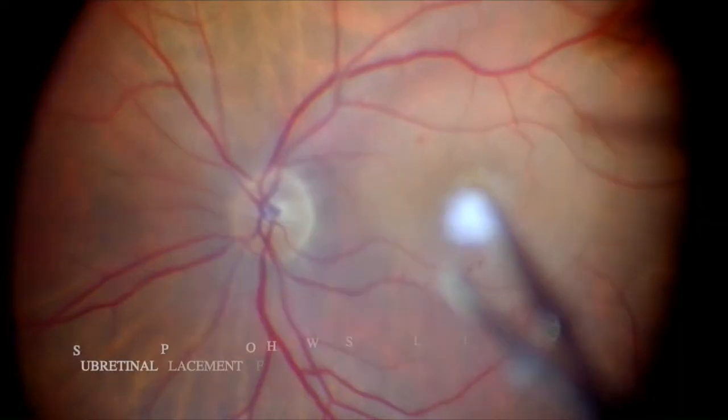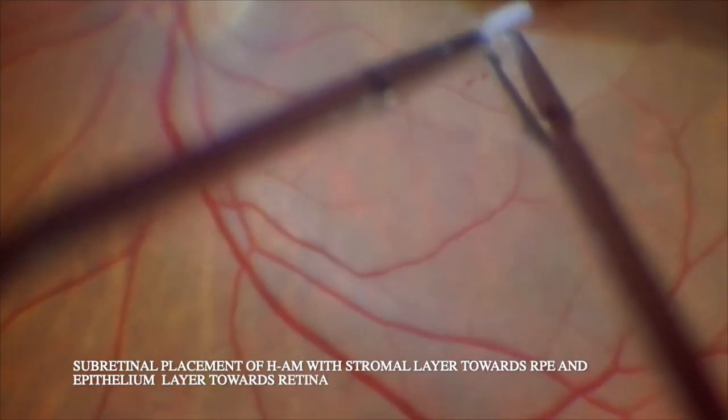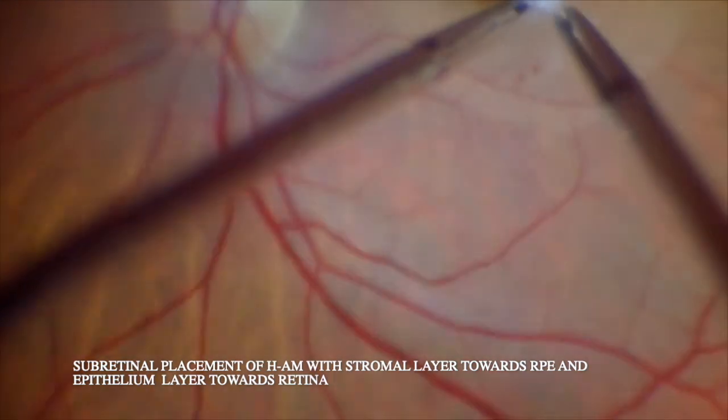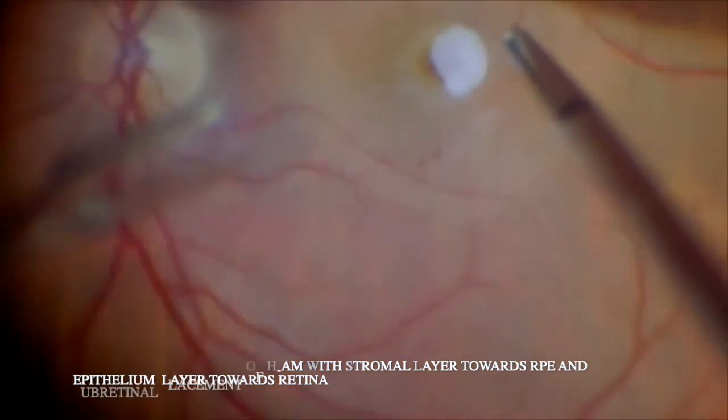The aim is to favor the interaction between the amniotic membrane, retinal structures, and the retinal pigment epithelium. There are a few published data in the literature — Rizzo published one paper in Retina in 2018.